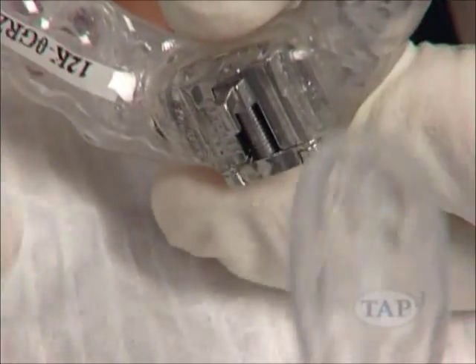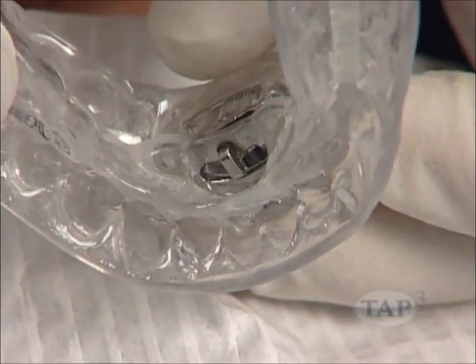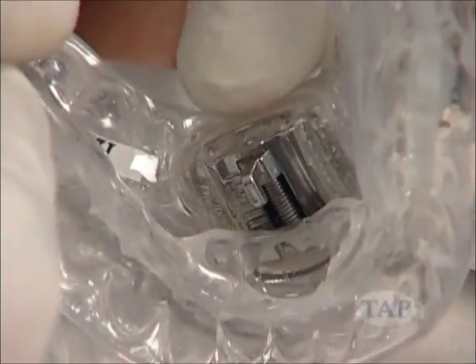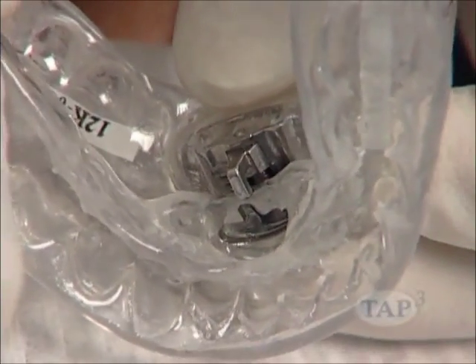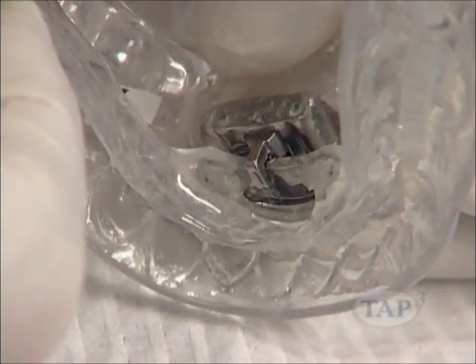If the patient needs more protrusion, the hook can be placed in two positions. The first position is in the slot of the socket. The second position is behind the slot of the socket, which gives the patient 6 more millimeters of protrusion.